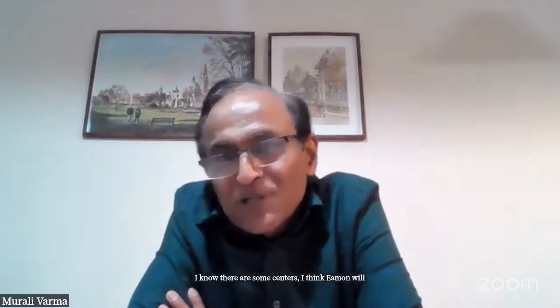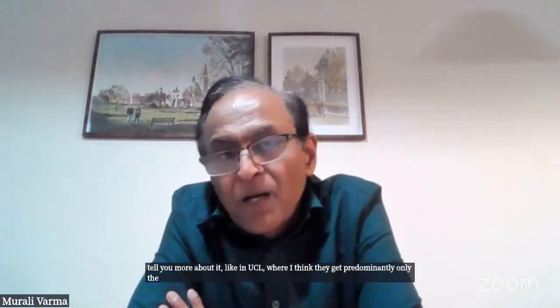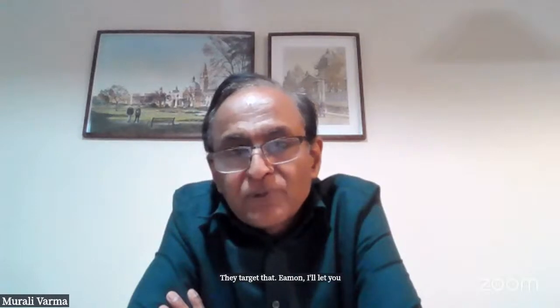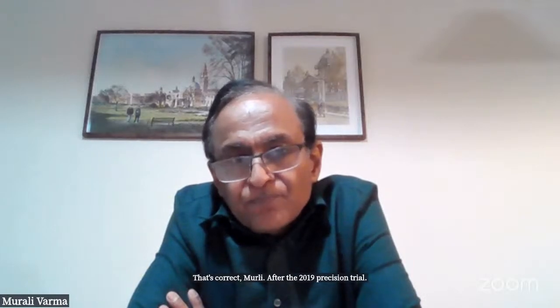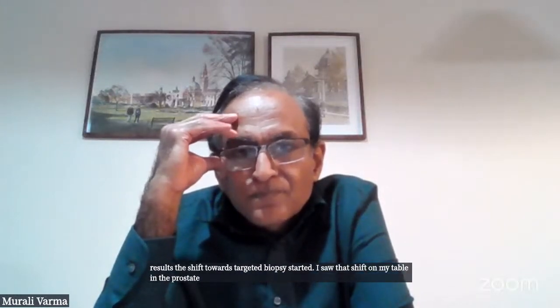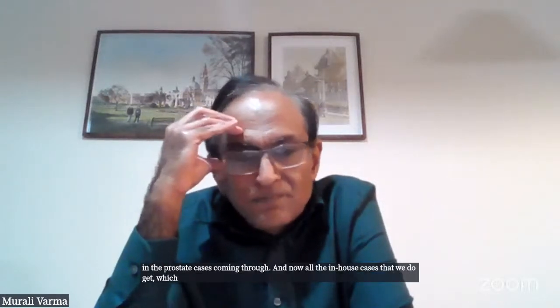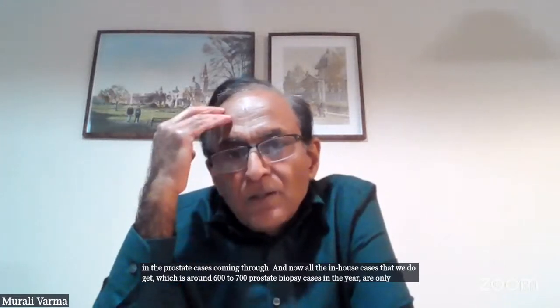I know there are some centers, I think Eamon will tell you more about it, like in UCL, where I think they get predominantly only the targeted biopsy. So if they see some PI-RADS lesion, they target that. Eamon, I'll let you take that. That's correct, Murli. After the 2019 PRECISION trial results, the shift towards targeted biopsies started. I saw that shift on my table in the prostate cases coming through. And now all the in-house cases that we do get, which is around 600 to 700 prostate biopsy cases in the year, are only targeted biopsies.